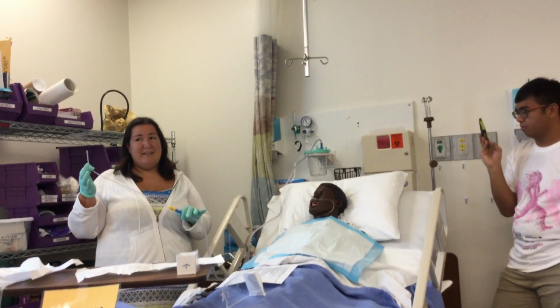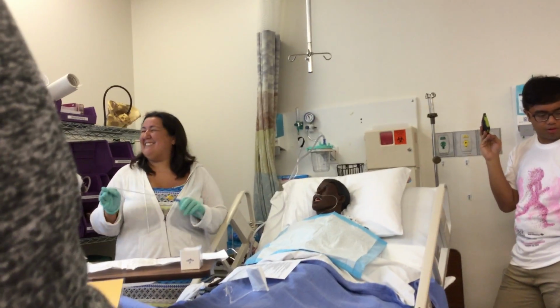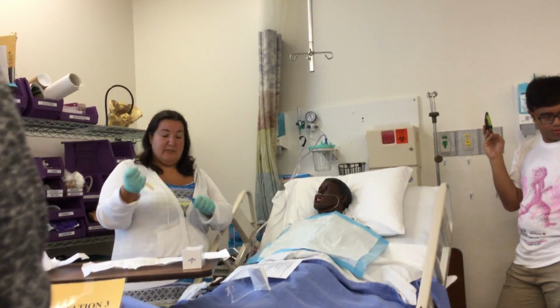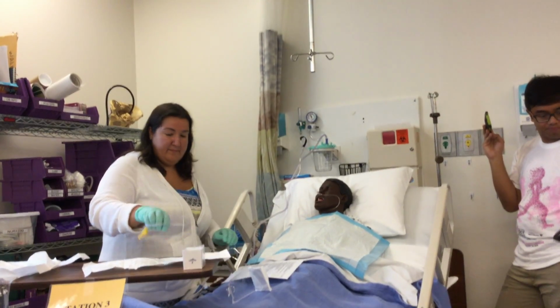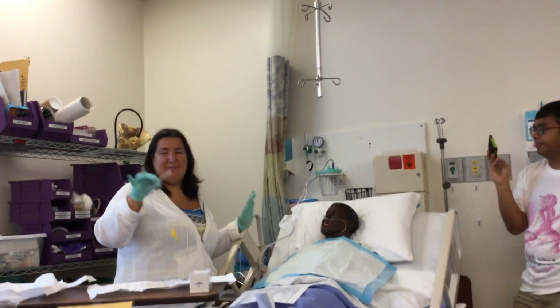It's a thin plastic. They can easily bite down on it, and then they're choking on the end of your catheter, which is not a good thing. So you're going to get rid of this. So for the demonstration, we're getting rid of it? Yep. You could just throw it in the garbage. Don't even try to save it.